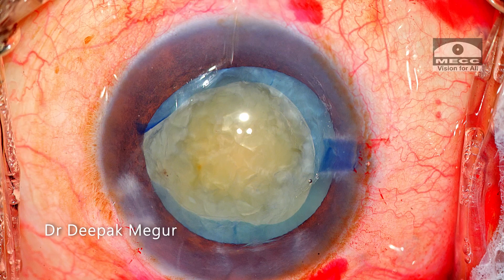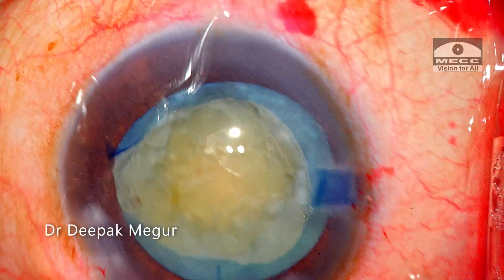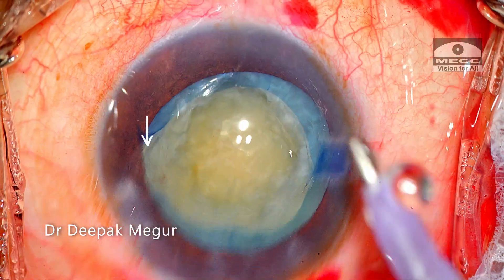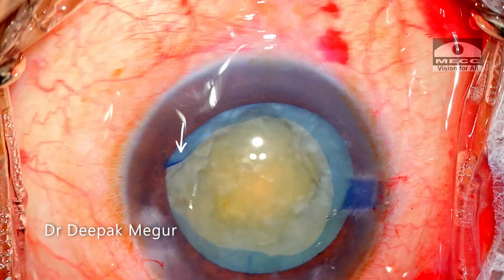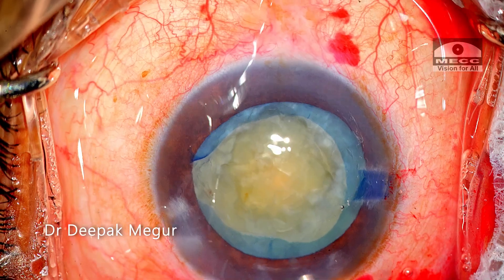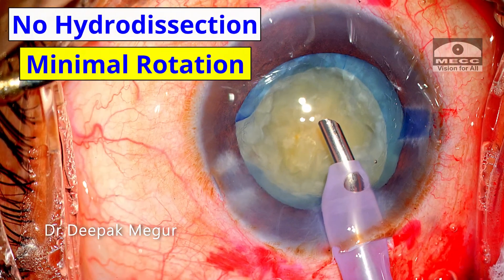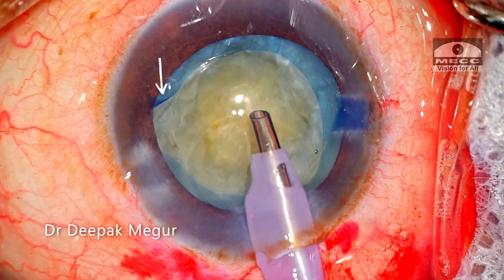The pupil is well dilated. The nucleus is not soft, but the good thing is that the edge of the torn anterior capsule is very well visualized and is currently everted and fluttering, which is a good sign. The principle of no hydrodissection and minimal rotation of the nucleus will be followed. With one eye on the flap, I begin phaco emulsification of the nucleus.